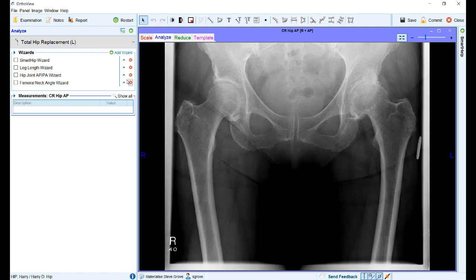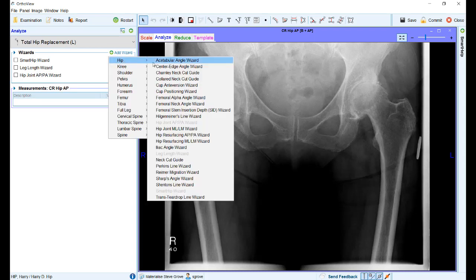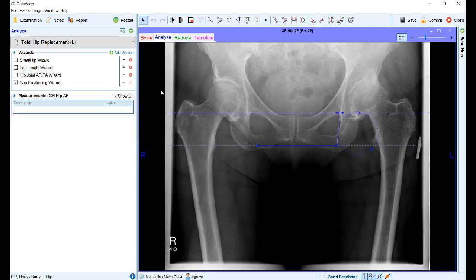In the analyze stage, users now have the option of reordering the wizards that appear in the panel. Clicking the arrows allows the order to be changed. Unwanted wizards can also be removed from the panel by clicking on the red X's. Additionally, through the add wizard button, additional wizards can be added, and their order will be remembered as per the user preferences.